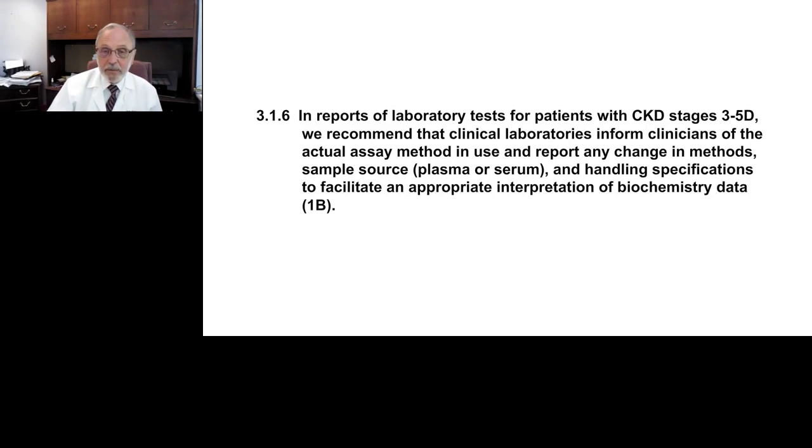And maybe what we'd like to see in the field is that if the lab reports a PTH value, it just says what assay is used. In our own hospital, for example, the hospital lab changed from one PTH assay to another and didn't inform the clinicians. So all of a sudden we began seeing values for PTH that were almost twice what we thought they should be in these patients.